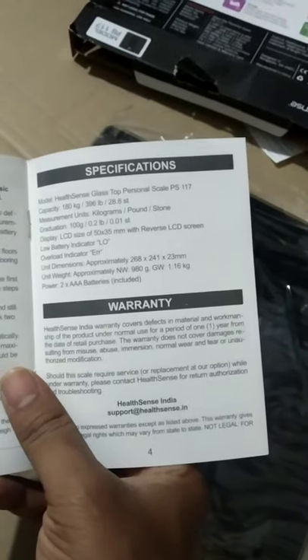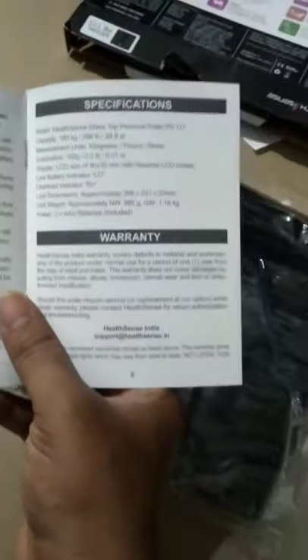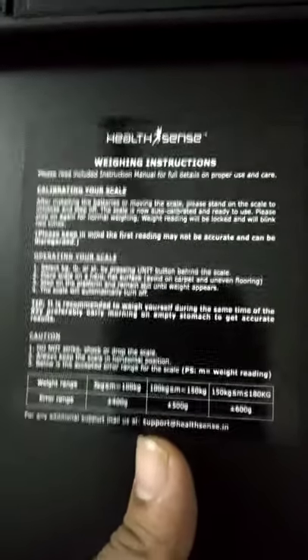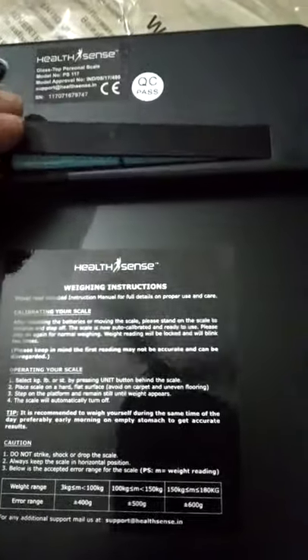They have provided the Health Sense glass top personal scale — model PS 117, capacity 180 kg or 396 lb. It looks like this. Here they have given careful information about the weighing instructions — you can weigh up to 180 kg. This is actually a shell-based weighing scale. I'm gonna check my weight on this one right now.